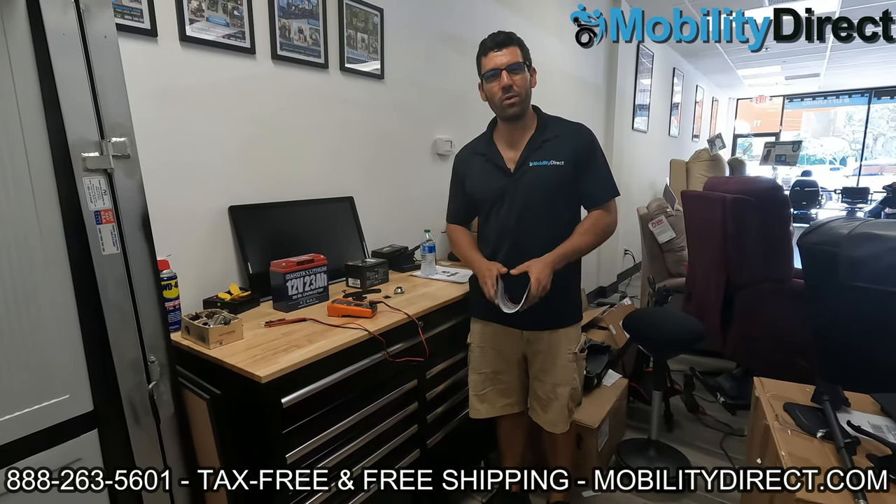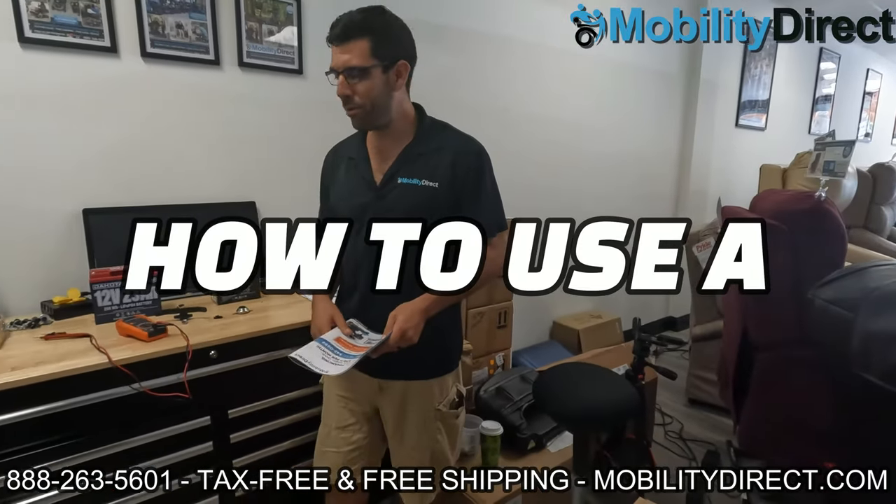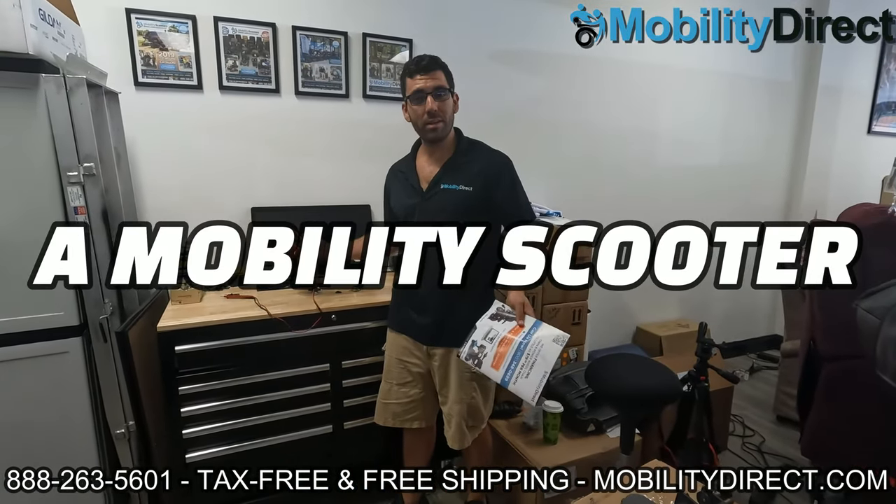Hey everybody, I'm Sergio with Mobility Direct, and welcome to our YouTube channel. In today's video, we're going to show you how to use a multimeter to troubleshoot your mobility scooter.